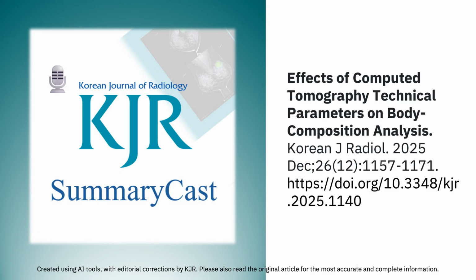I'd assume more noise means more variability, a wider spread of HU values. That's exactly right. But the effect on the average value is inconsistent across studies. A phantom study cited in the paper found that reducing the tube current led to lower muscle attenuation. But a clinical study comparing low-dose PET CT scans to diagnostic CTs found the opposite, higher muscle density in the low-dose images. So the noise can seemingly push the average HU value up or down. The net bias is uncertain?